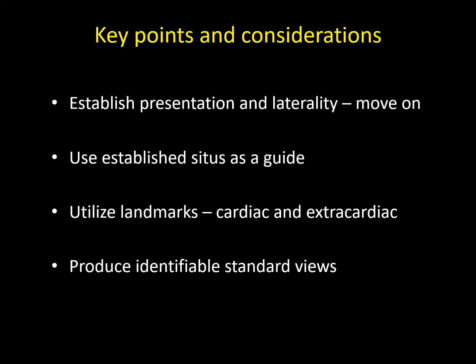And so when you're looking for left or right-sided structures, whether it's cardiac structures or extracardiac structures, you've got that situs as a guide to tell what is left and right on the fetus. And the landmarks that you will see both in the heart and outside of the heart, like the trachea and the stomach, are perfect landmarks to establish the situs and sidedness of structures within the fetus, whether it's within the heart or within the fetal body. And most importantly, you want to produce identifiable standard views. And this is so critically important for a successful scan.